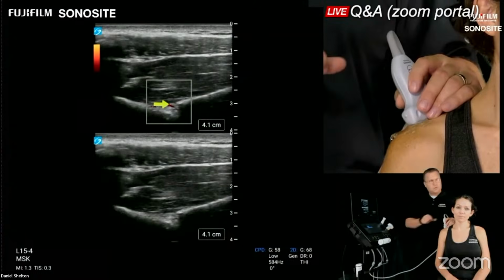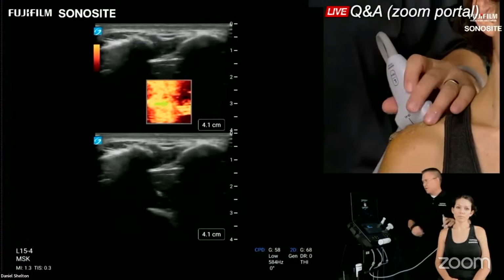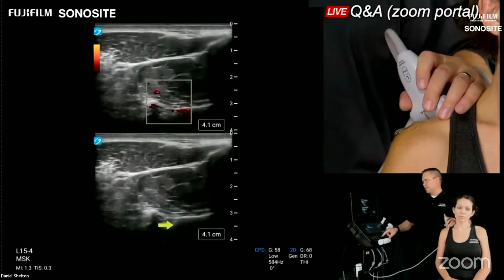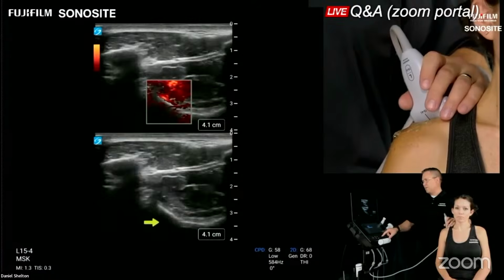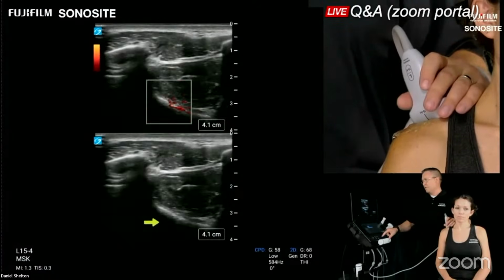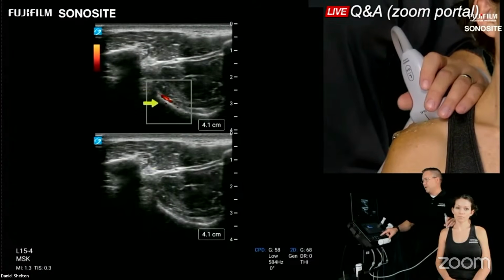That's the most common view, but what I'm going to do is just rotate the transducer. Left side of the screen will be anterior. We're going to get a short axis shot. I'm focusing on the bottom of the screen so I don't get all that arterial flash. I know that screen left is anterior, so I expect that artery to show up right there on that neck of the coracoid. It's going to start dropping itself right across that slope. There it is, of the supraspinatus fossa.